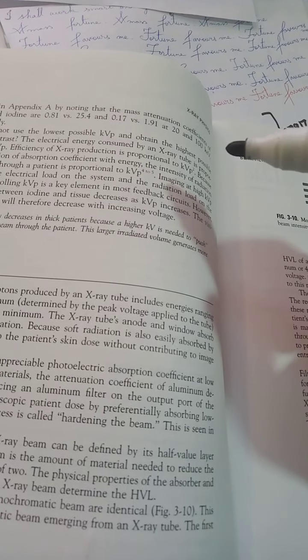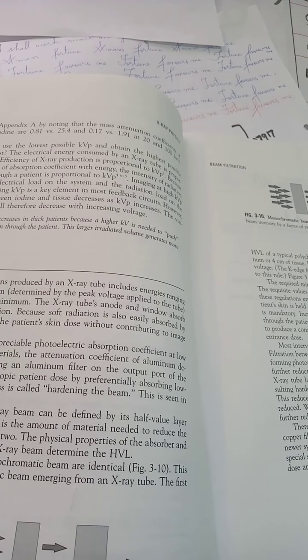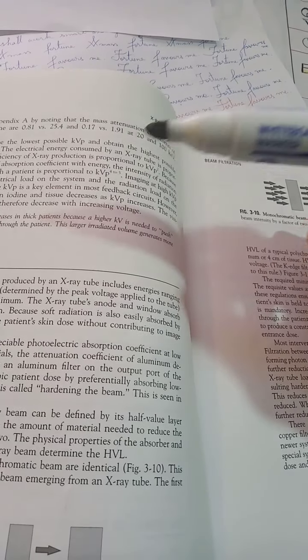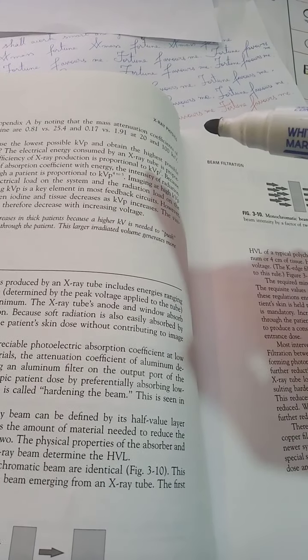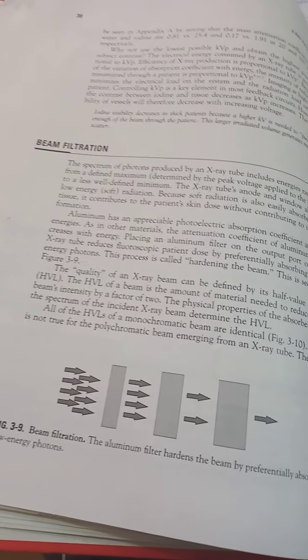However, the contrast between iodine and tissue decreases as voltage increases. So that's also a problem. If you increase the voltage, iodine would stop functioning as a contrasting compound. The visibility of the vessels will therefore decrease with increasing voltage. Iodine visibility decreases in thick patients, thick as in thicker skin density, thicker bone density, because a higher kilovolt is needed to push enough of the beam through the patient. This larger irradiated volume generates more scatter. So unfortunately, it has its negative aspects as well.